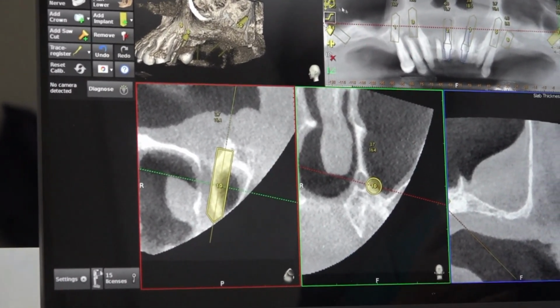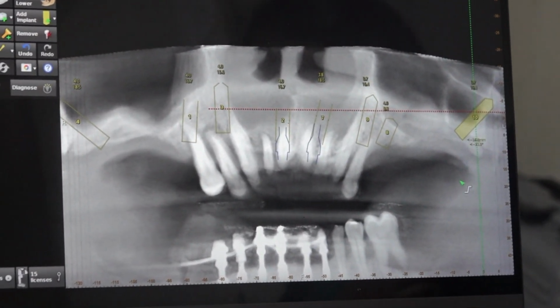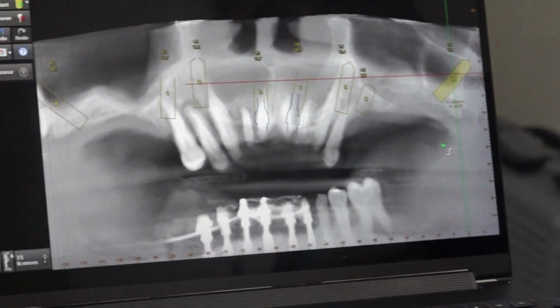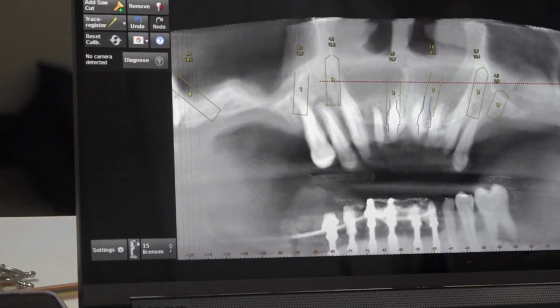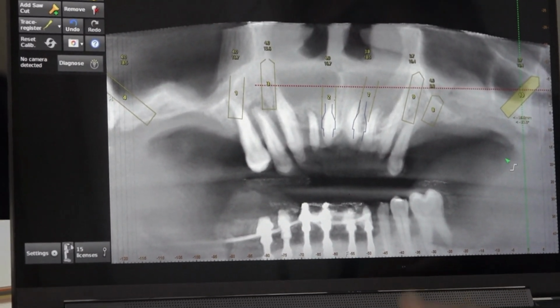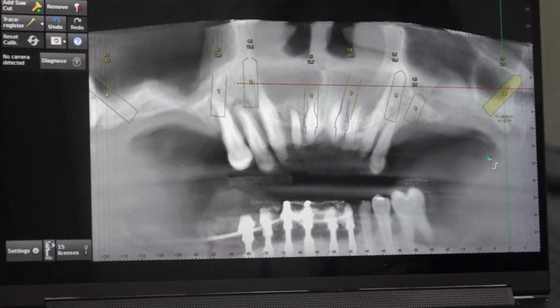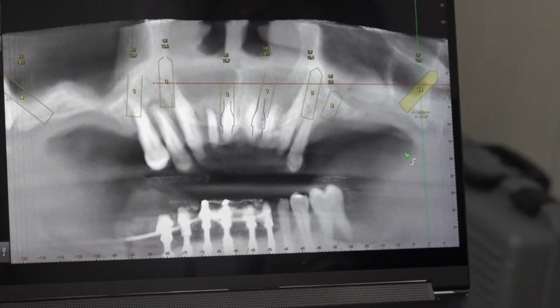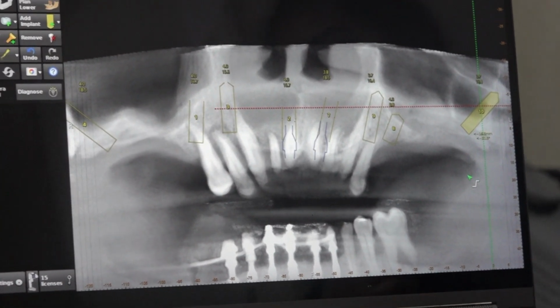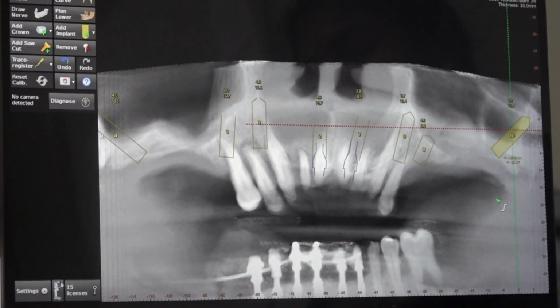Okay, so doing single piece in this kind of scenario is not a good idea, especially with welding. Because the last pterygoid, when you put BCS, it will be too elastic, too flexible. And if you do welding, no, the inter-implant distance also will be more. So better to go for titanium. If you are planning for single piece, better to go for a metal framework. You should not do welding. Welding will lead to failure.